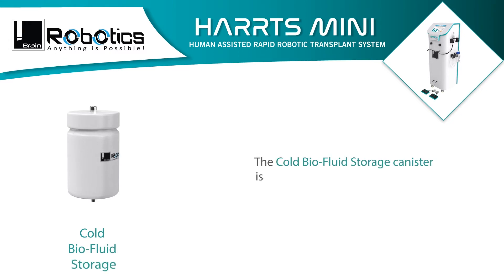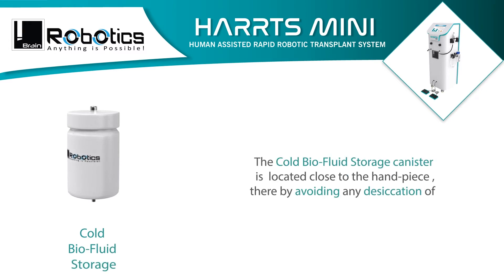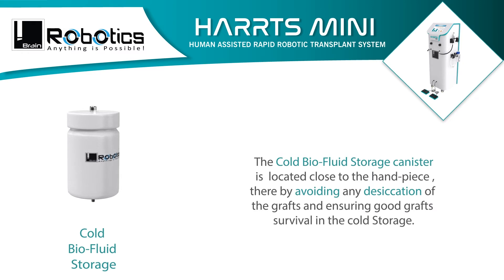The cold barrier fluid storage canister is located close to the handpiece, thereby avoiding any desiccation of the grafts and ensuring good graft survival in cold storage.